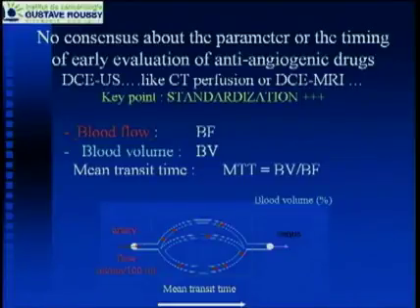In fact, you have to understand, if you have a tumor, you could evaluate this tumor in different ways. You could evaluate, in red here, the blood flow, which perfuses the tumor. You could also evaluate the blood volume, and often in publications you have these parameters. The blood volume is the percentage of vessels in the total tumor. This is like the MVD, the microvascular density at histological analysis, but with functional criteria. And we could also measure the mean transit time.